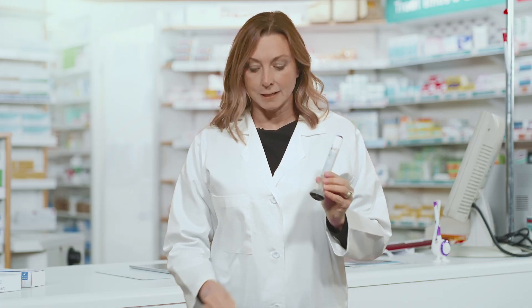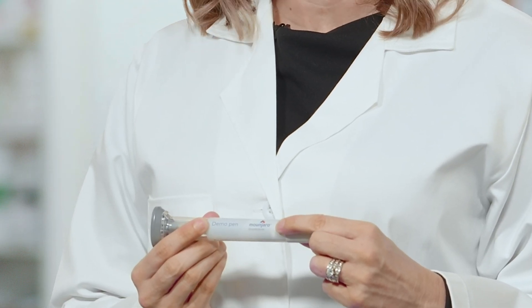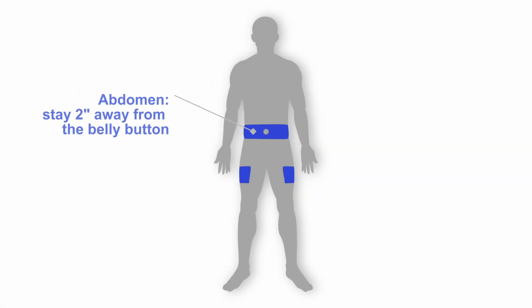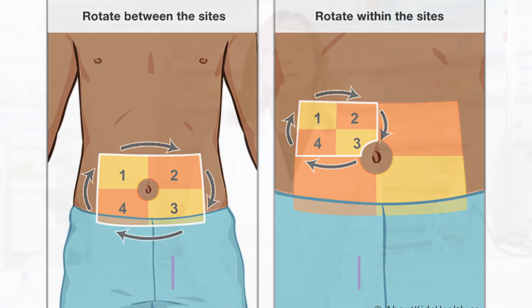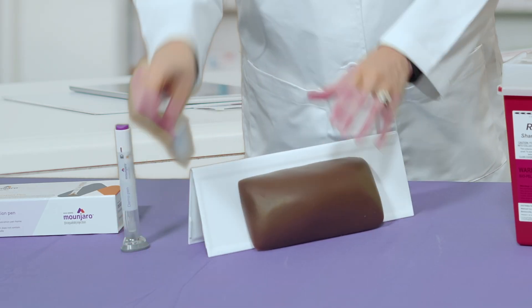To prepare for your injection, you will need the pen and an alcohol swab. Read the label and expiration date to make sure you have the correct medication and that it has not expired. Choose your injection site. You can inject either in the abdomen, staying two inches away from the belly button, or your thigh. I will demonstrate an injection into the stomach. Always try to rotate injection sites from week to week, and separate injection sites by the width of one index finger. Rub the injection site with alcohol and let it dry.